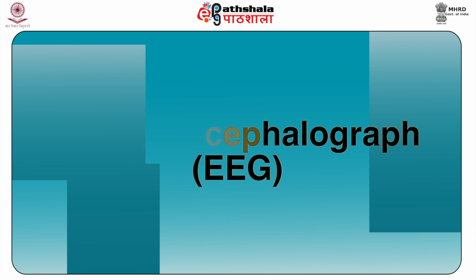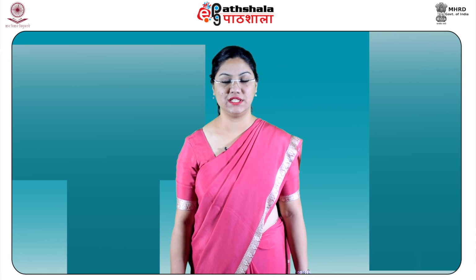Electroencephalograph, EEG. Electroencephalograph is the electric recording of the brain without opening the skull or any use of radioactivity. Electrodes are placed on the scalp of the organism and the normal wave patterns of the brain activity at specified regions of the brain are recorded and the pictures produced through a computer.